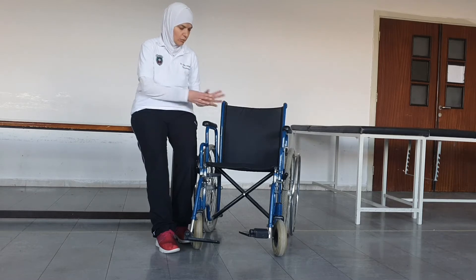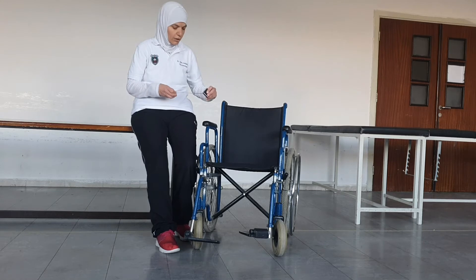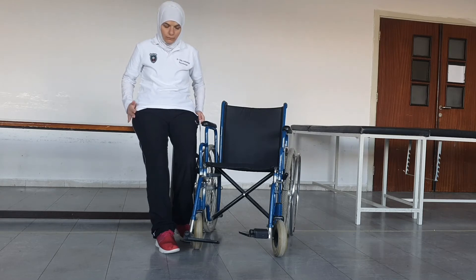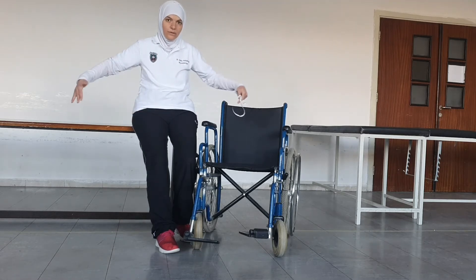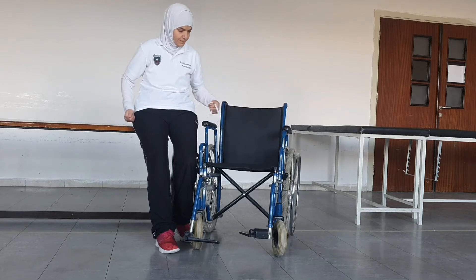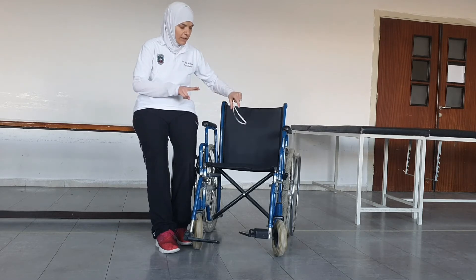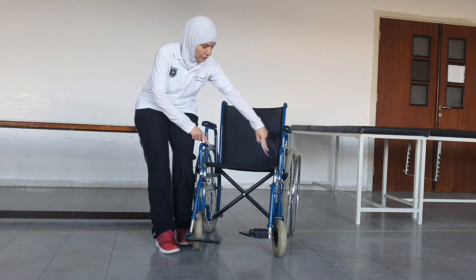The first measurement is the pelvis width. This is very important to compare with the width of the chair, which is the distance between the two seat bars. The chair cannot be narrower than the patient's pelvis width. It can be slightly wider, but not too much — if it is too wide, the patient's shoulders will be in a disadvantaged position. We typically keep two fingers' width on either side, so the patient sits comfortably. We take the pelvis width, add two fingers on each side, and that gives us the seat width.